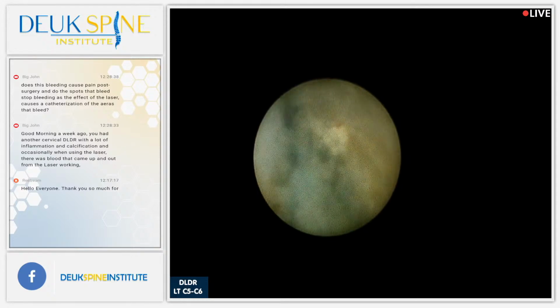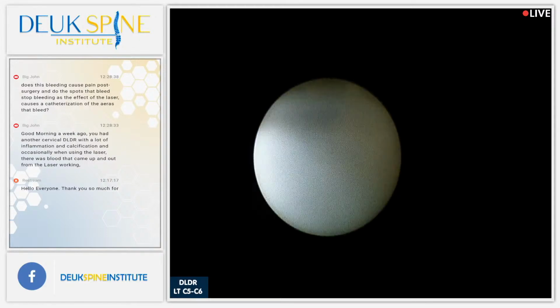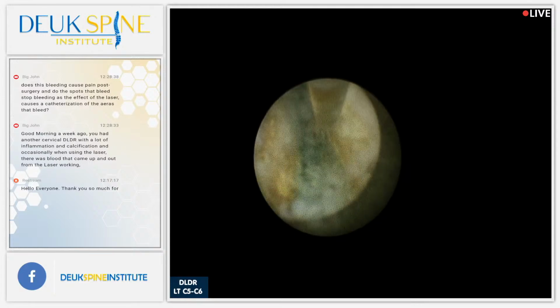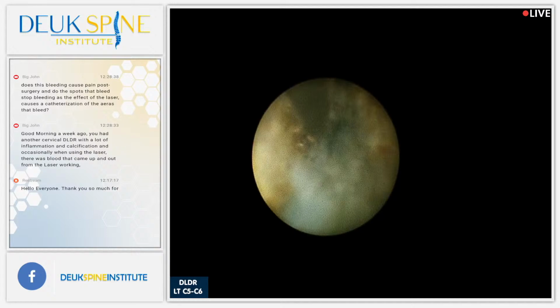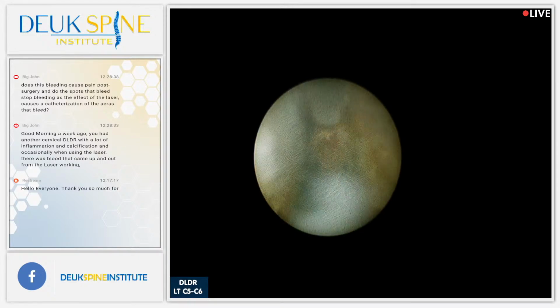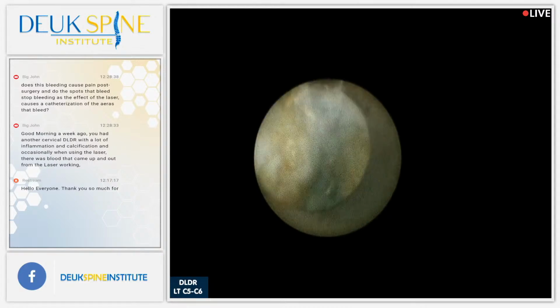The amount of bleeding is very minimal, and it's not a concern. However, as you pointed out, that causes inflammation and pain. So it brings on a new type of pain usually, but in the same area as where patients had the problem before. So yes, removing bone spurs, it does get bloody.